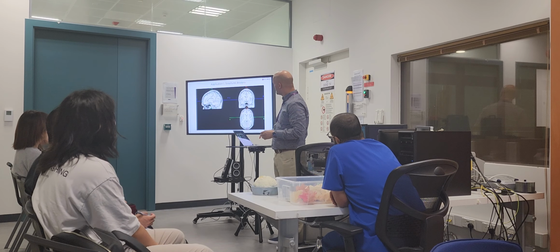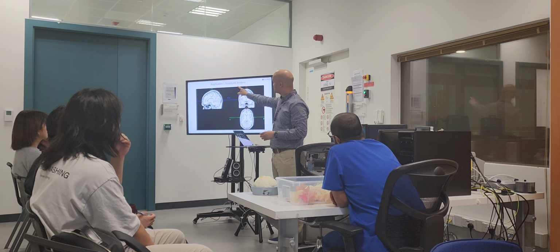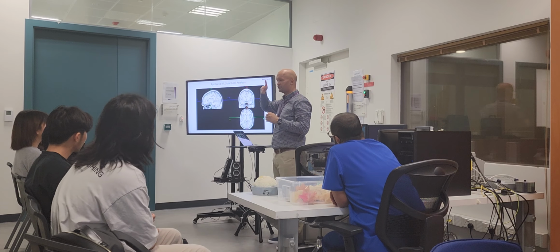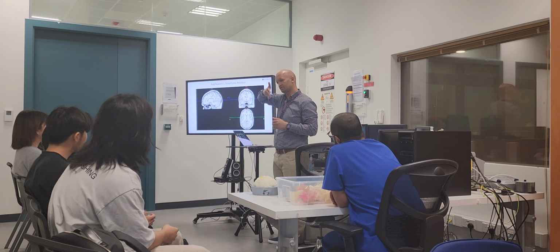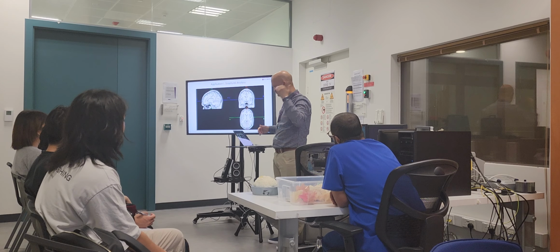Okay. So you're looking at the same scan. This is what we call a sagittal view. So you're looking at the side. This is called the coronal view. So you look at the front, and you're cutting front to back or back to front. And this is you're cutting horizontally.